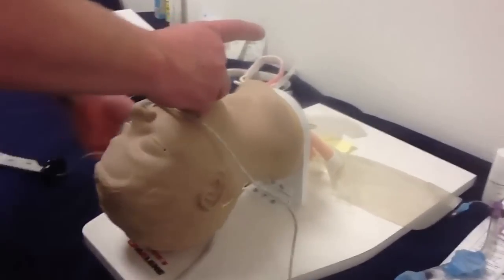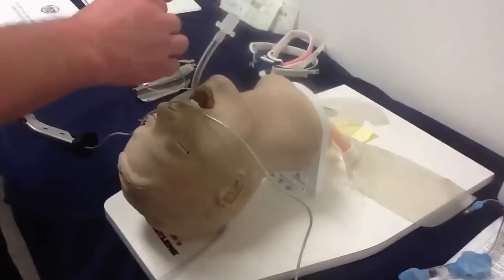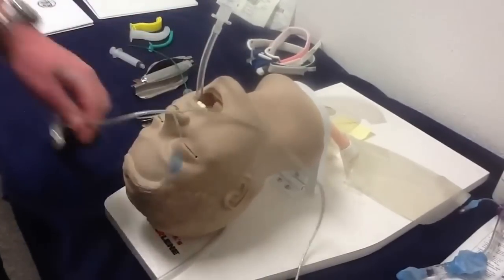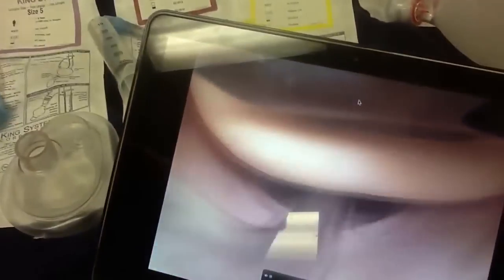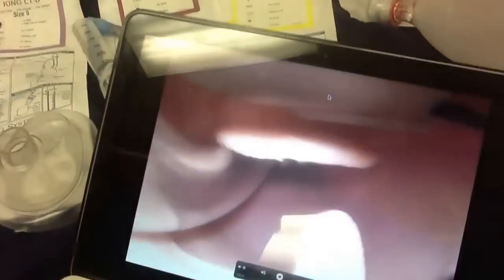It comes out — click here. Now we have an established tube. You can even go through post-intubation and also verify tube placement, to make sure that the tube is good. So even after an intubation, you can see if the tube is successful.